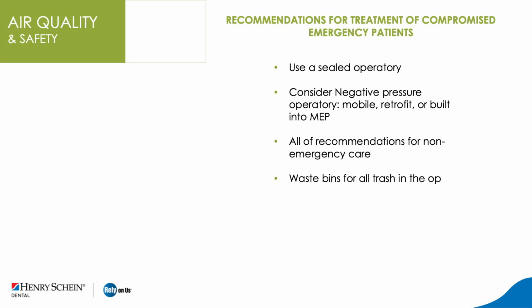Now, here are some recommendations for treatment of the compromised emergency patient. These are going to be in addition to all the recommendations for non-emergency care that immediately follow this slide. We want to use a sealed operatory and consider a negative pressure operatory, either one that has built-in infrastructure in the mechanical, electrical, and plumbing infrastructure of the office, or a mobile unit, or some other retrofit that's been created for at least one operatory in your office.